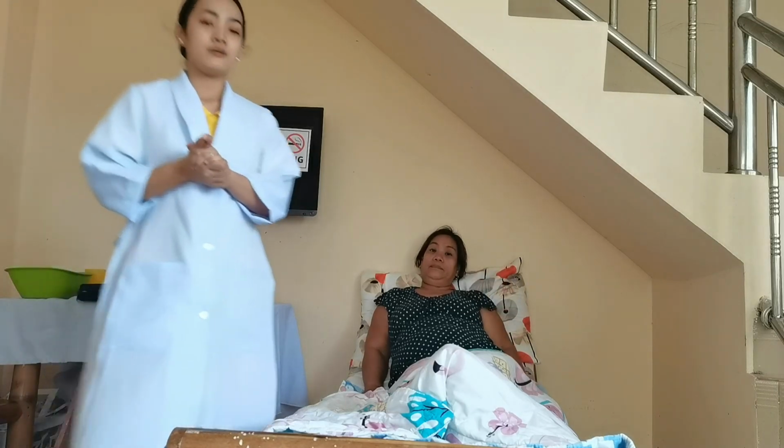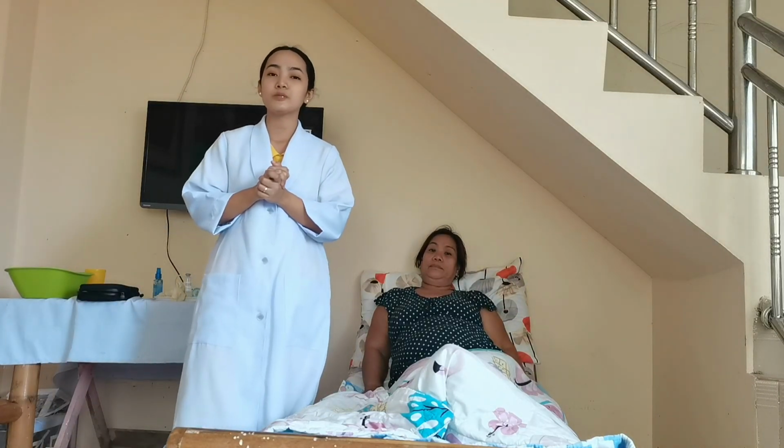So, that concludes my return demonstration for this procedure. Thank you.